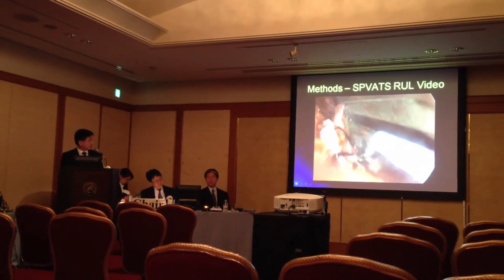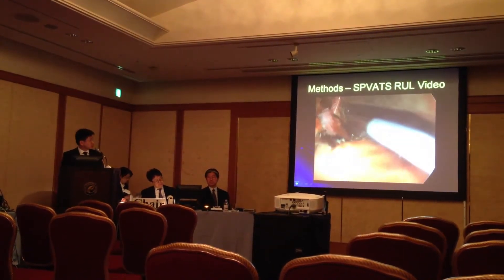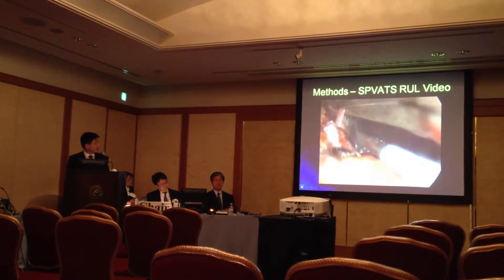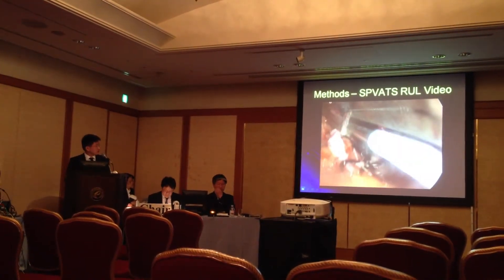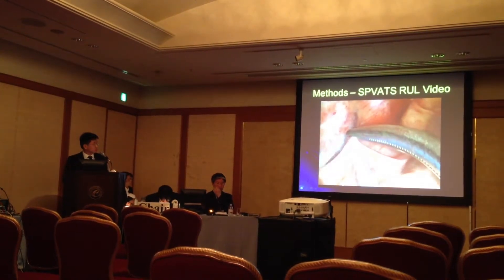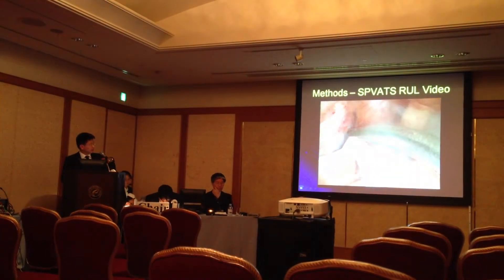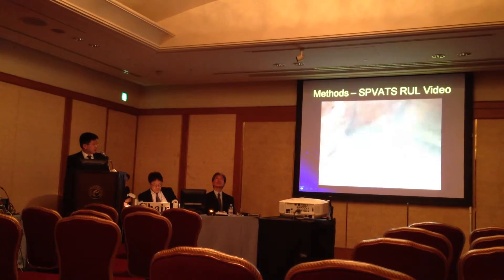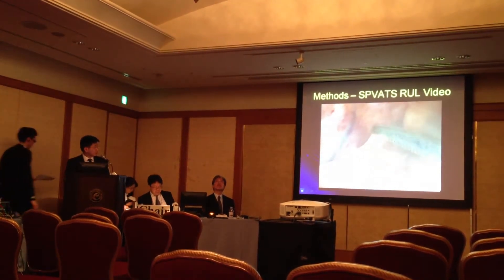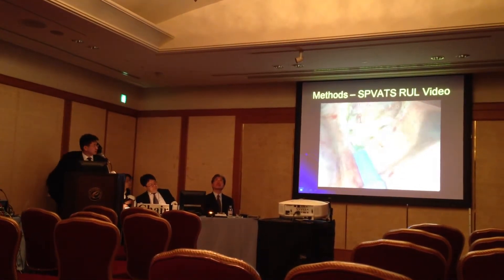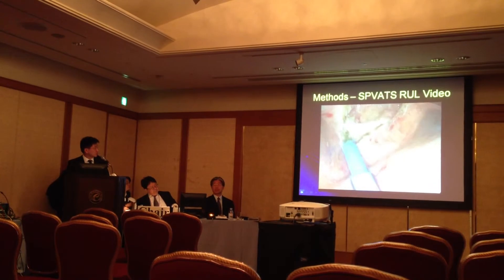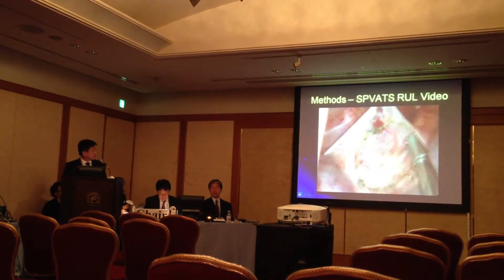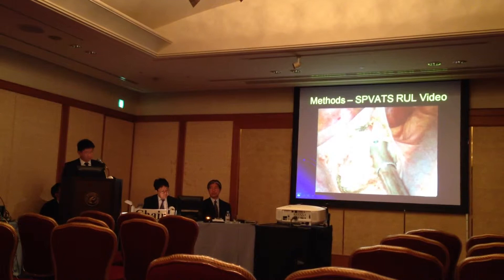We also perform hilar dissection for lymph nodes — you can see a lymph node in the interlobar area. We do a standard subcarinal dissection by pulling the lobe forward and then dissecting the subcarinal area. We also open the paratracheal space completely to look for lymph nodes.